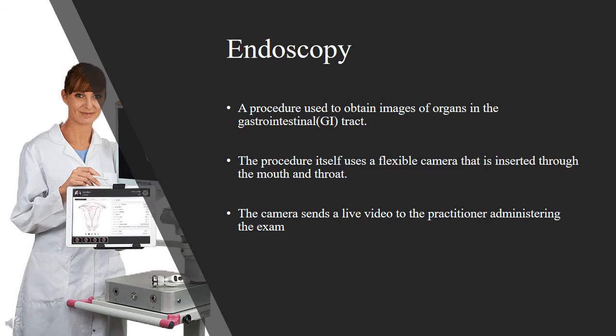Endoscopy is a procedure which takes a video of the esophagus, stomach, and small intestines. The procedure itself uses a flexible camera which is inserted through the mouth and is led throughout the upper gastrointestinal tract. The images are displayed on a live monitor.